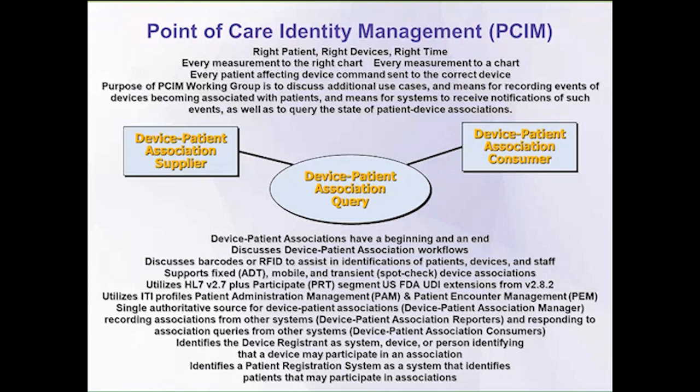If you think of other domains within IHE, there is a lot of patient association with information for reports, for example. The ITI domain does do a great job in doing that for reports, and they also manage things like the admit, discharge, and transfer information. So when we went to do this, we had to think about where is the information being sourced from? How is the information made use of? How better can we get access to this information?